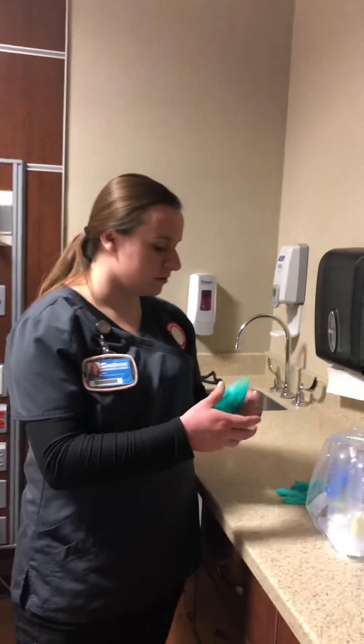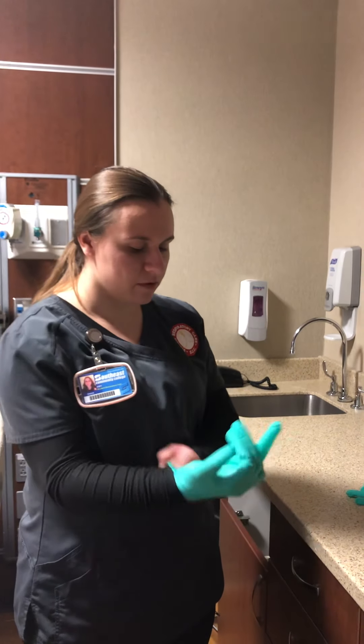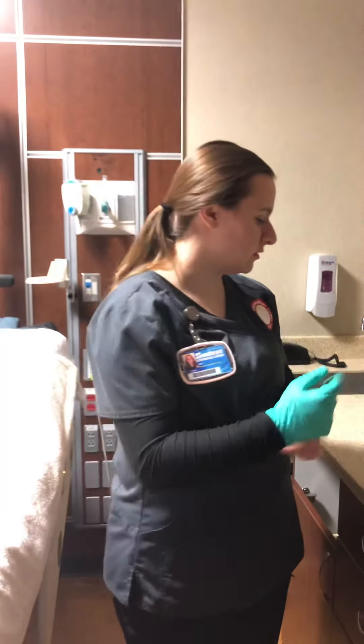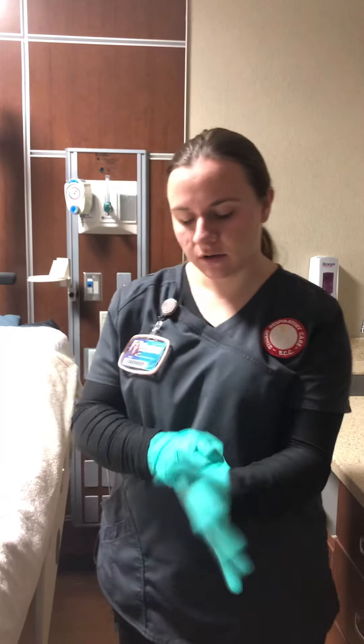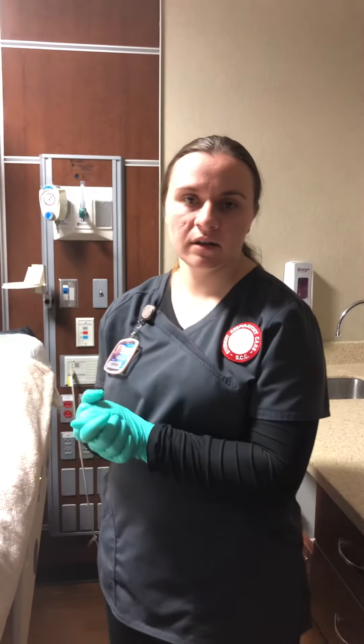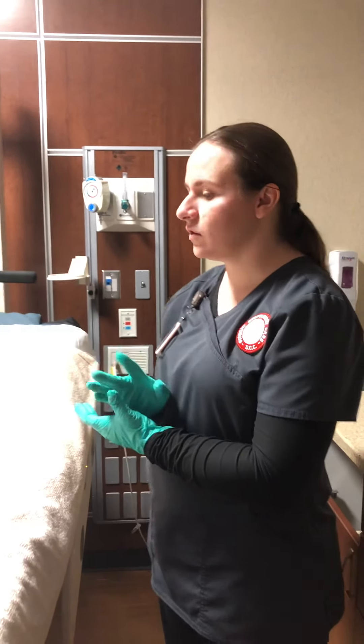When I'm ready I'm going to knock on the patient's door and introduce myself, check the patient's ID band, and then wash my hands and apply the appropriate PPE. I'm just going to wear gloves because I don't feel there's any splashing or anything like that. Then I'm going to assess the patient — listen to their lungs, check their breath sounds, and check their vital signs.